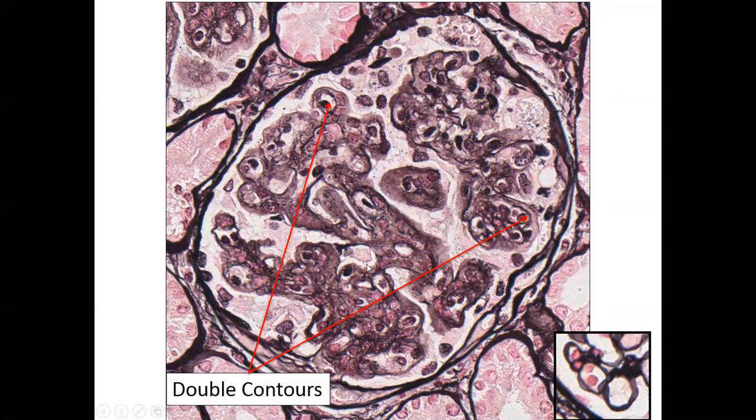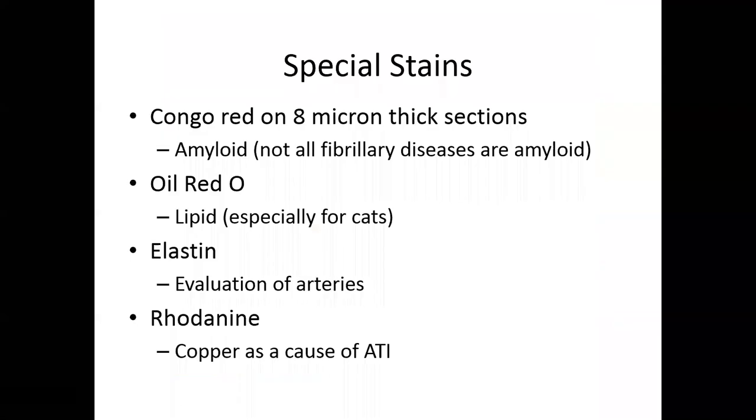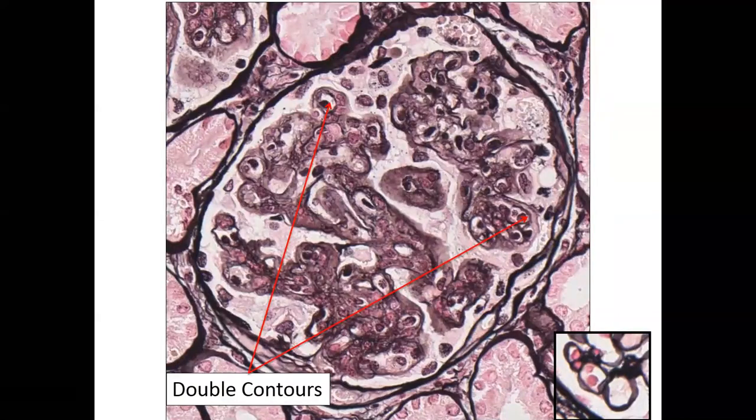When I look at these kinds of cases on EM, these immune complexes for this type of disease, these subendothelial immune complexes, they're usually quite variable in size, and they can be quite large. We often talk about how they become confluent with one another. So it's not like in this disease where they're discrete immune deposits sitting in between spikes. And I will show you EMs of all of these, I promise. Okay?